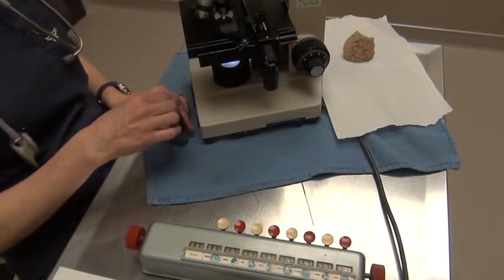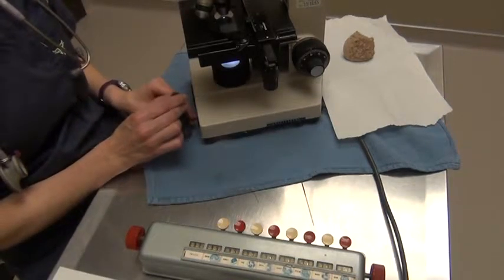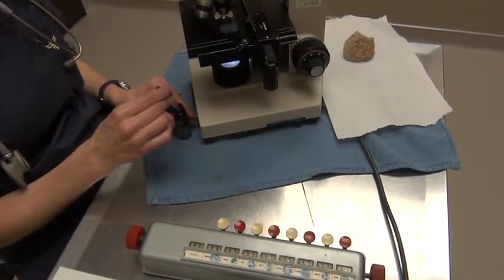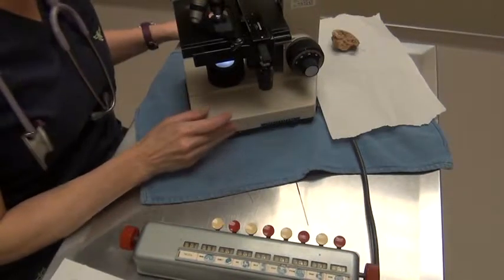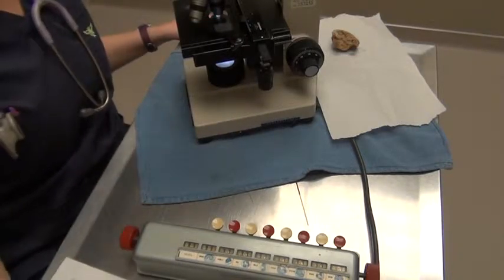So what we'll do is we're going to go to 100. I'm going to put a drop of immersion oil, and we're going to refocus. And I'm going to find the edge of the monolayer and begin my count, and start by describing the red blood cell morphology.